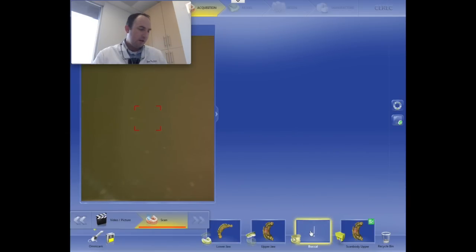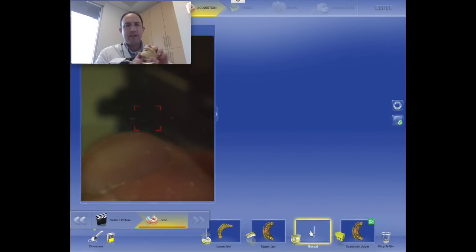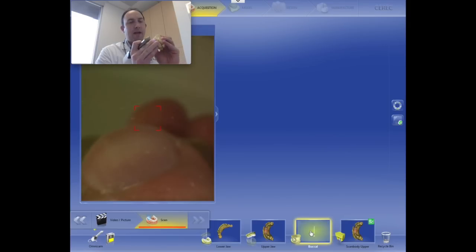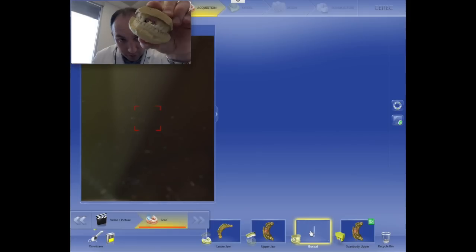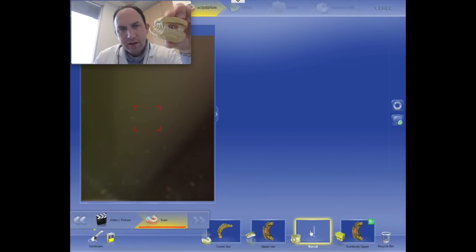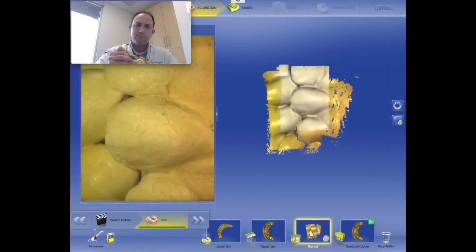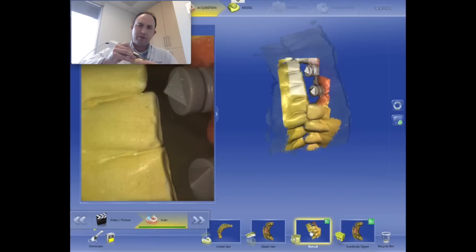When we go down to the next image set, the buccal, I'm just going to hand articulate these. They articulate really stably. I do have a blue moose bite that we took, but these articulate in a very stable manner. And you can also see, if I can get it lined up there, that there's no impingement on those tibases. So this should work just fine. Make sure they orient real tightly and there's no shifting. And then I'm going to take that buccal scan. And I like to kind of sweep up and down. And you can see the computer has already pulled the modeling in.